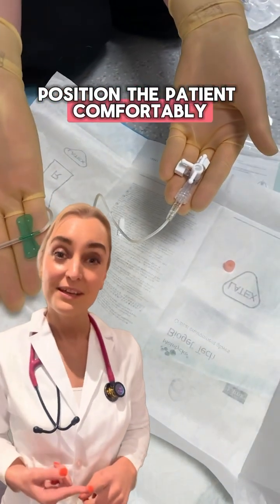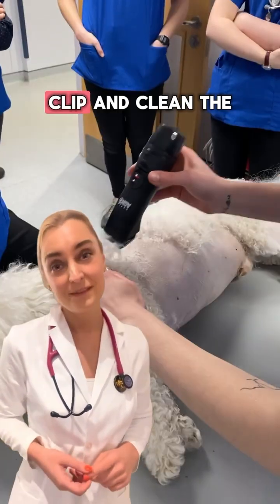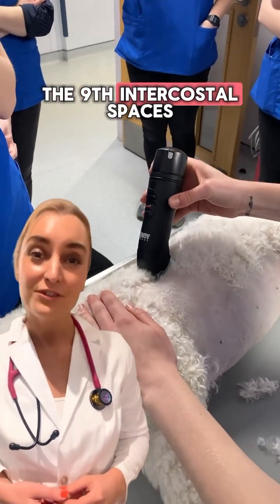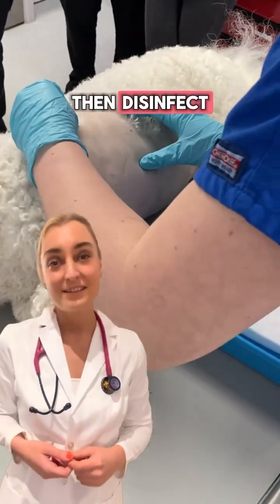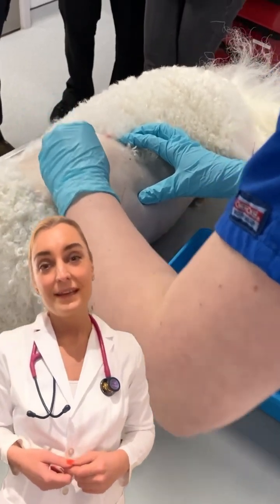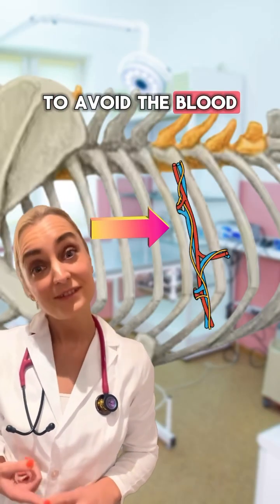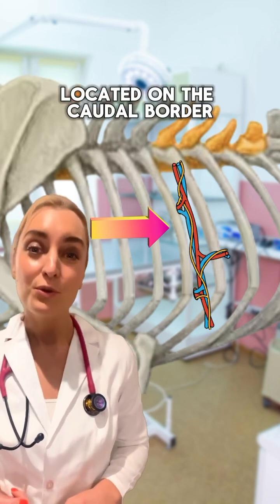Position the patient comfortably. Clip and clean the area, typically between the 7th and the 9th intercostal spaces, then disinfect. It's important to insert just cranial to the rib to avoid the blood vessels and nerves located on the caudal border.